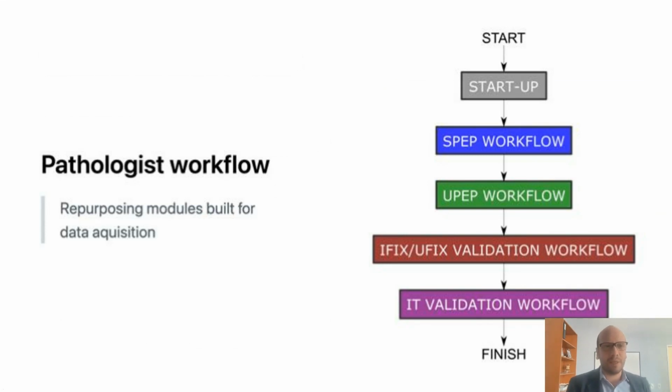All right, so the major challenge here, looking back, was that while the technologist's workflow has become much simpler, since they don't have to do all these transcriptional steps, the pathologist's workflow has become a bit more complicated. Previously, the pathologist would simply sign a piece of paper and move on. Now they had to learn a digital workflow involving various modules within the Phoresis software.